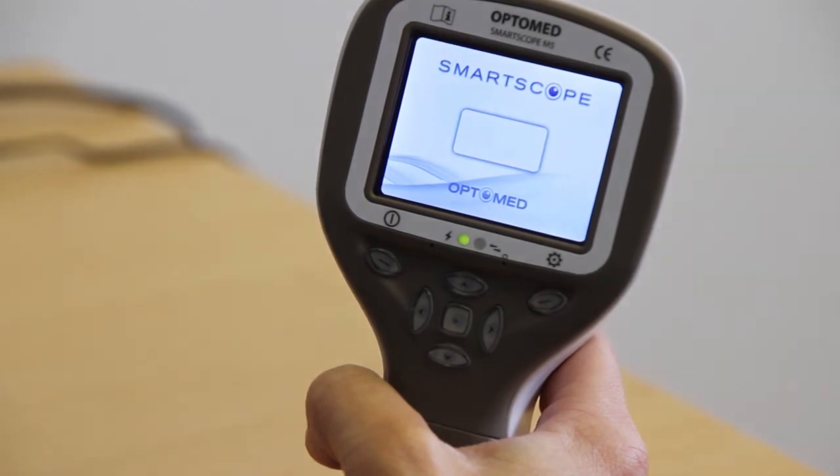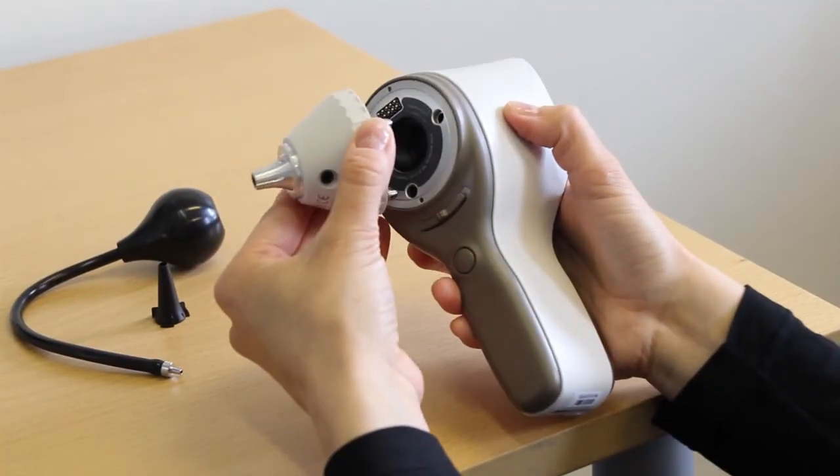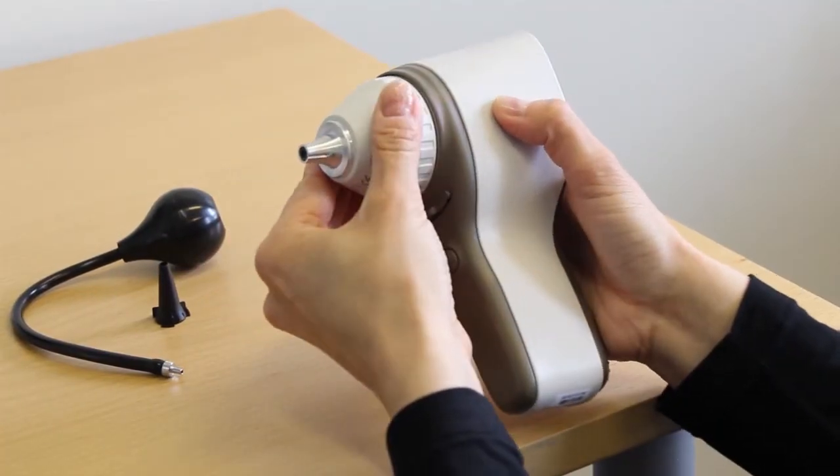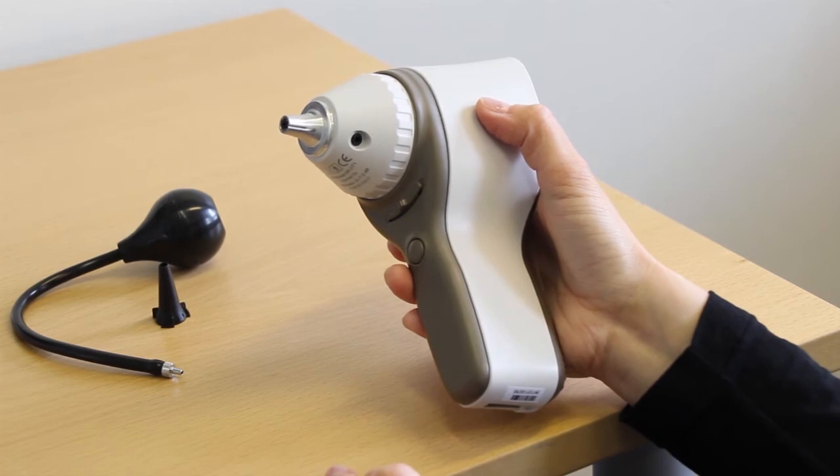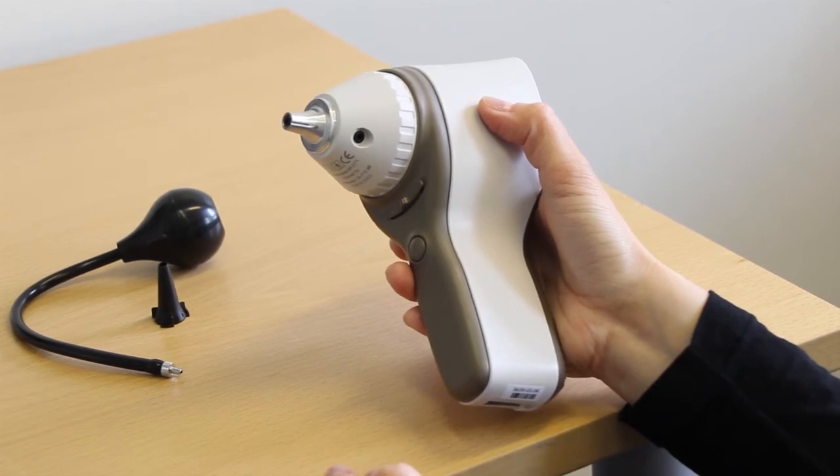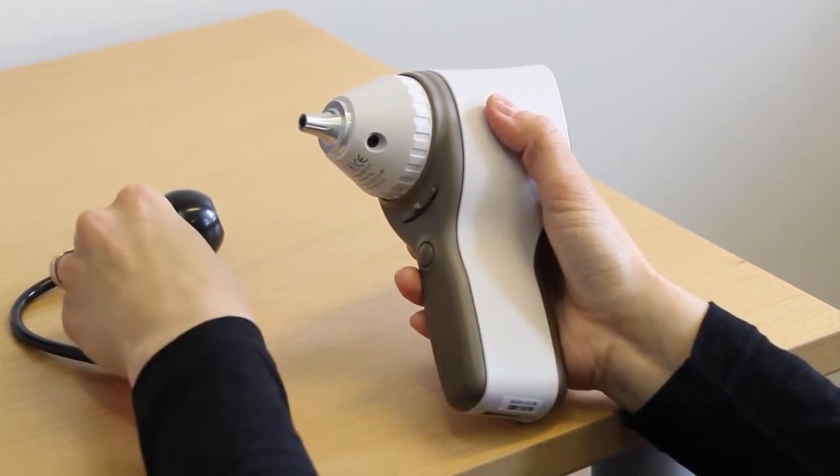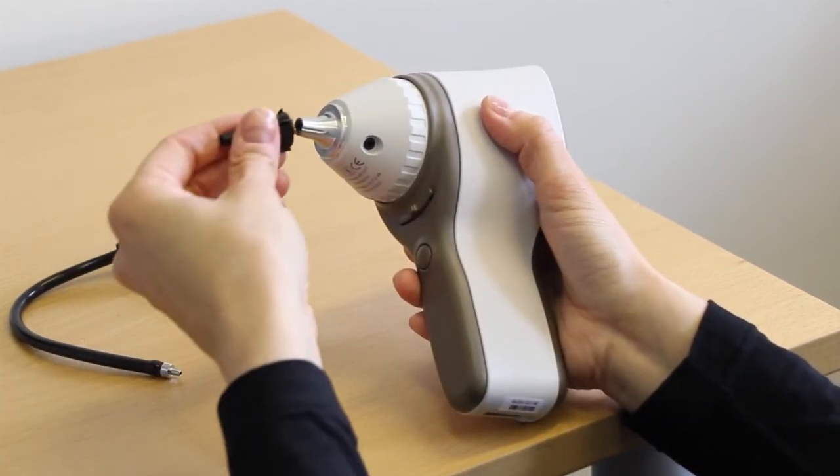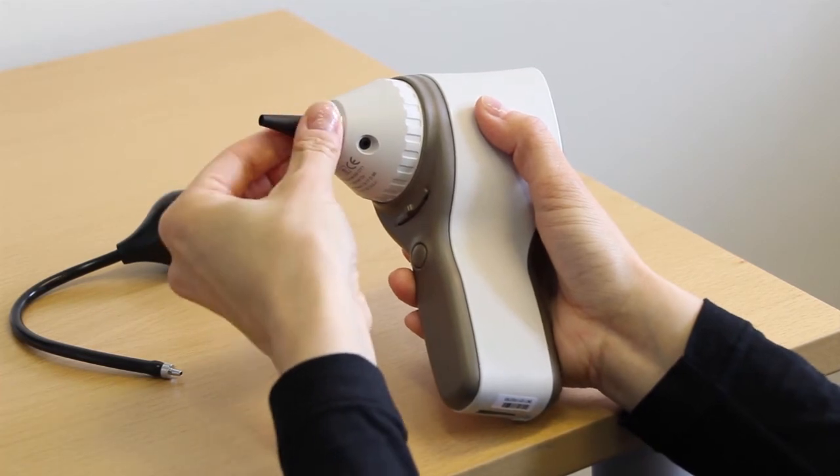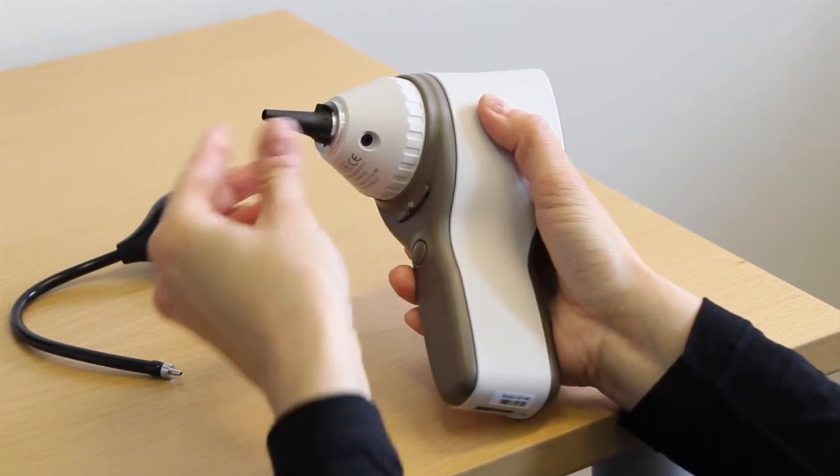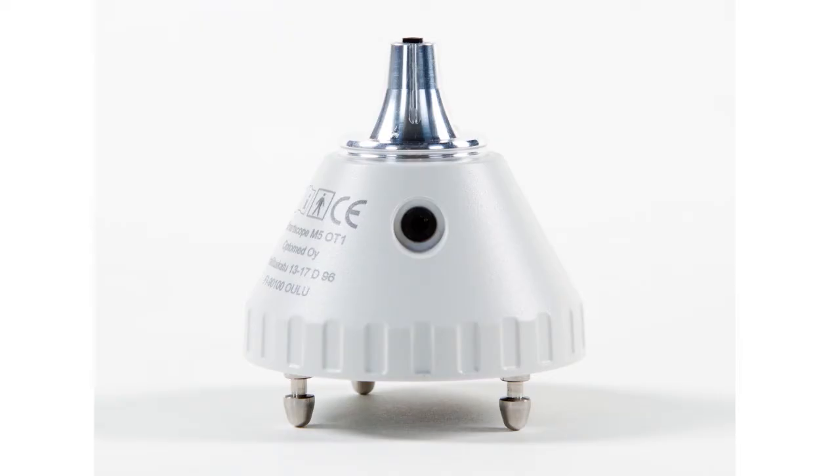Attach the OT-1 otoscopic optics module by pressing it firmly into place until you hear a click. Attach the speculum by twisting it into place. The OT-1 optics module can be used with any widely available Beta-Heine or AllSpec speculum.